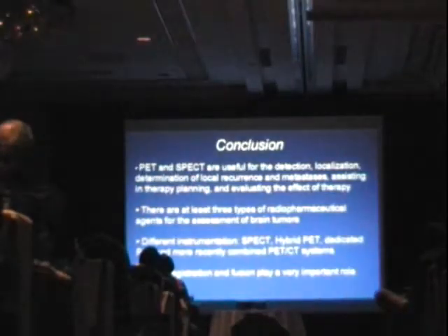So just to conclude, PET and SPECT are useful for looking for local recurrence and metastases, assisting therapy planning, and assessing the effect of therapy. And that's it.